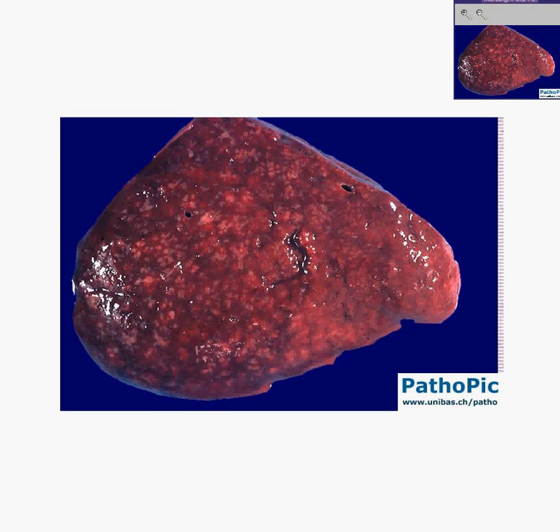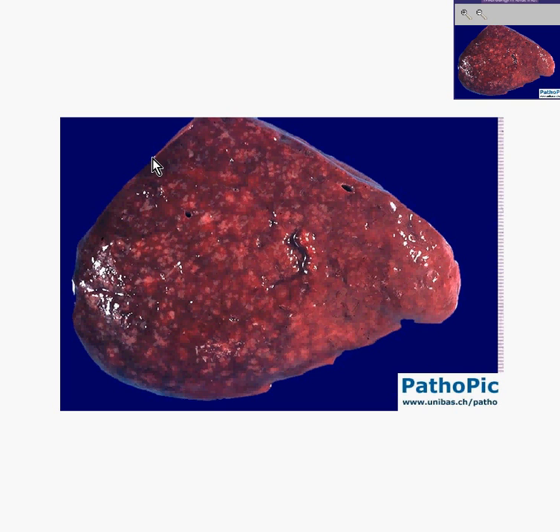Here is another nice interesting case. We can see a really nice spleen here, with a smooth surface. We don't know how big it is, but we could suspect it's bigger than it should be because it appears to be filled with something.